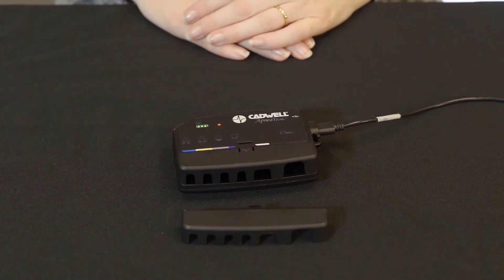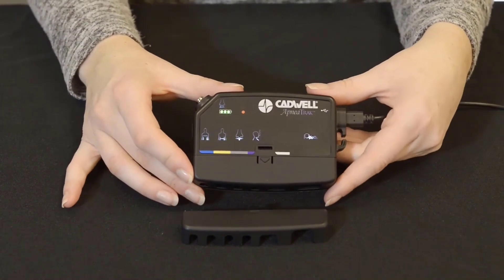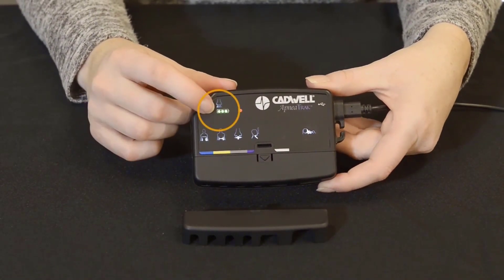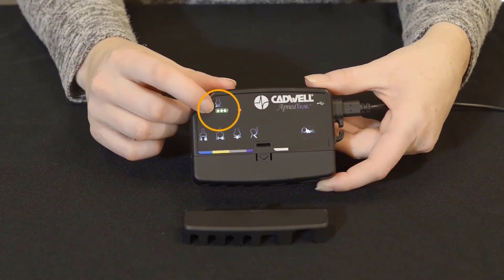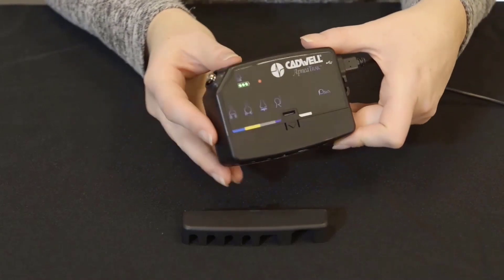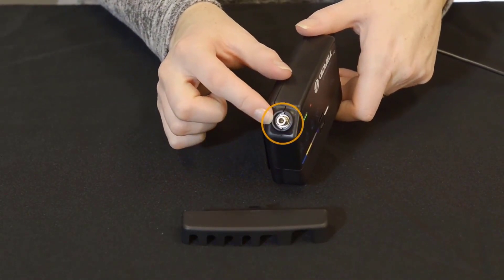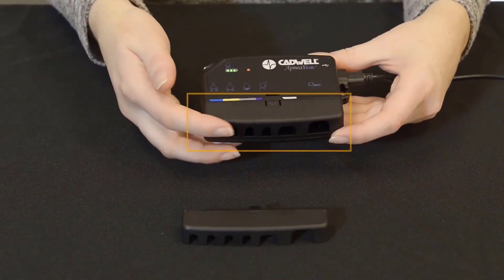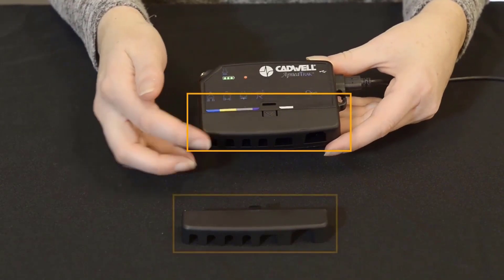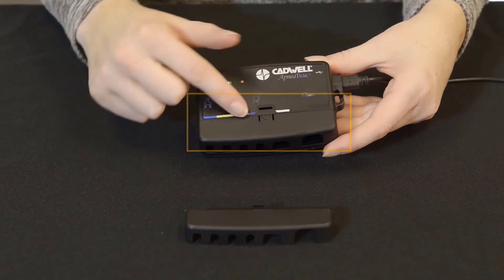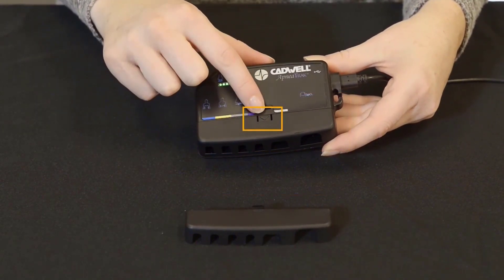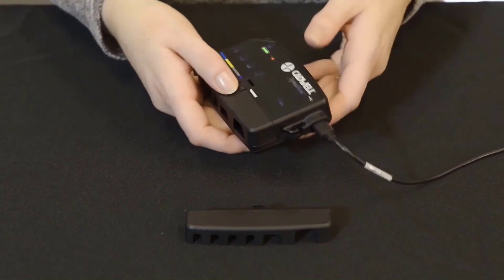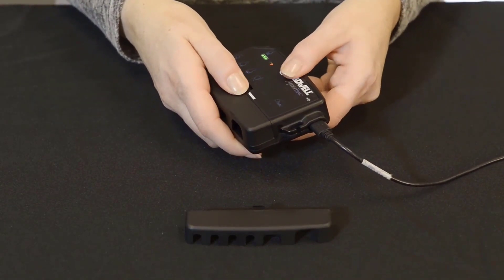Let's get to know your ApneaTrak. Looking at the front of your device, you will see the battery LED lights when the device is charging. The top left corner is the lower lock for your nasal cannula. Across the bottom of the device is a cover. Your device comes with two covers. One cover has a raised arrow that can be removed by pressing down on the arrow and pulled away from the device.